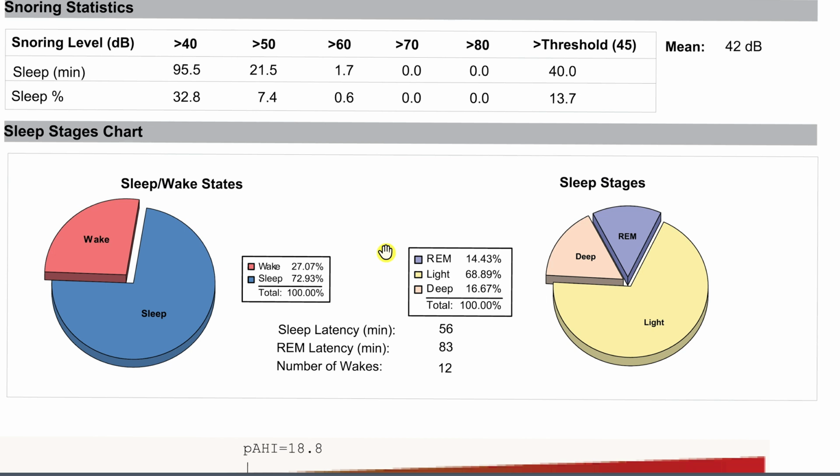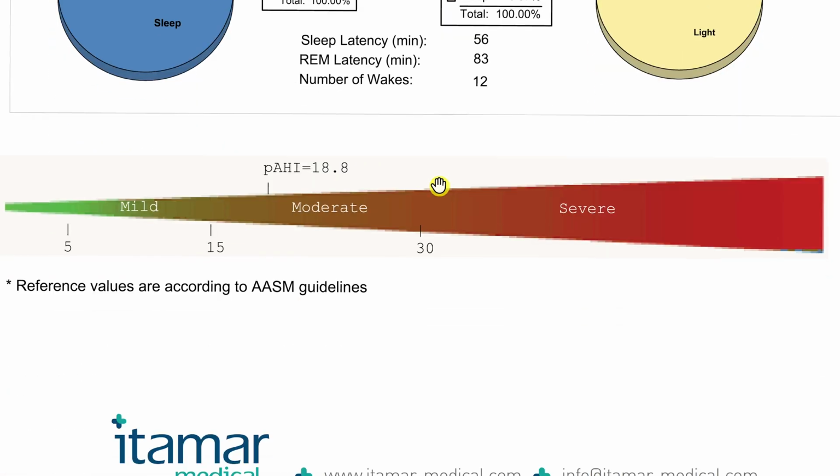Record your data. Record how you subjectively feel. Oscar provides that software, and you can even record how you subjectively feel. I have videos about that. Do it. Trust me, because you're not going to remember. Do not rely upon your memory to tell you 3 months from now how you felt on X day with X settings and so on. Over time, you smash yourself into the wall enough, and you'll find a course of treatment or a combination of treatment variables which work for you that you may not have found had you not recorded long-term data and had the ability to look at it from a different vantage point. Okay, speech over. I'll leave you in peace there.